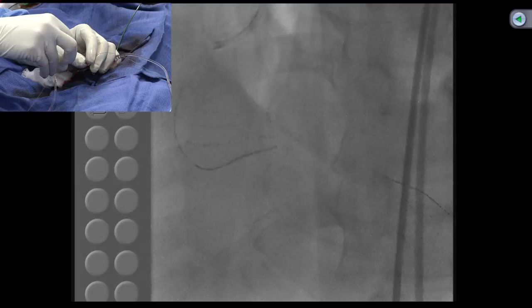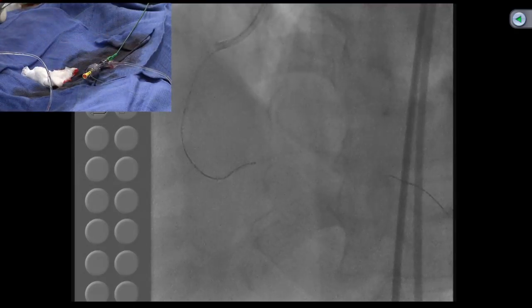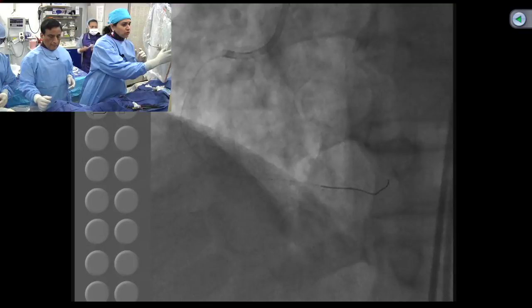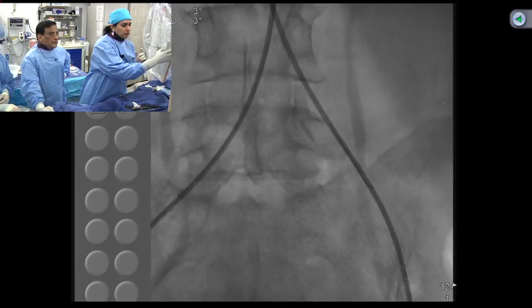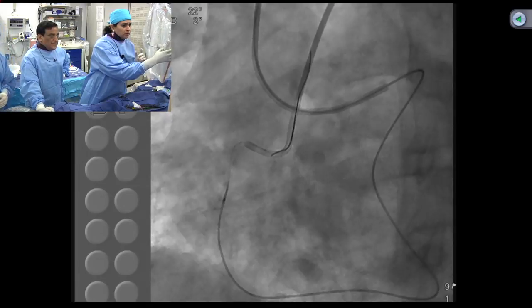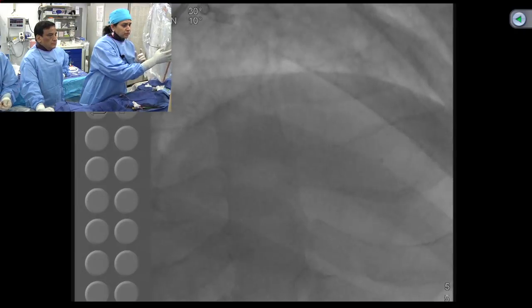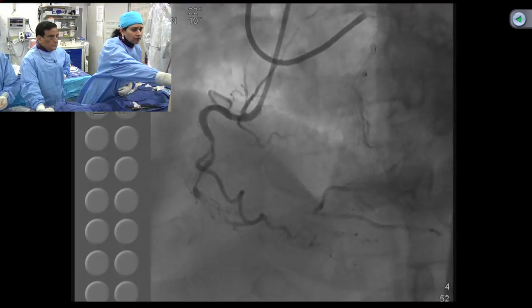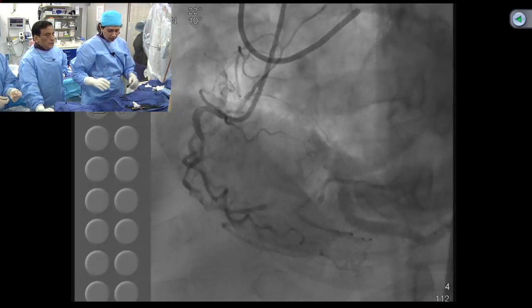No, but is that the PDA? Because this is the large PDA. If this is the large PDA, then we just keep it this way. Then fine. You want to take another picture? Just one second. Go to stent across. The question is, we want to see which vessel we are in now, is that our large PDA? I think it is. See, this is the PDA, and this is the small other branch. I think you're in the right branch. Good. Just stent across.